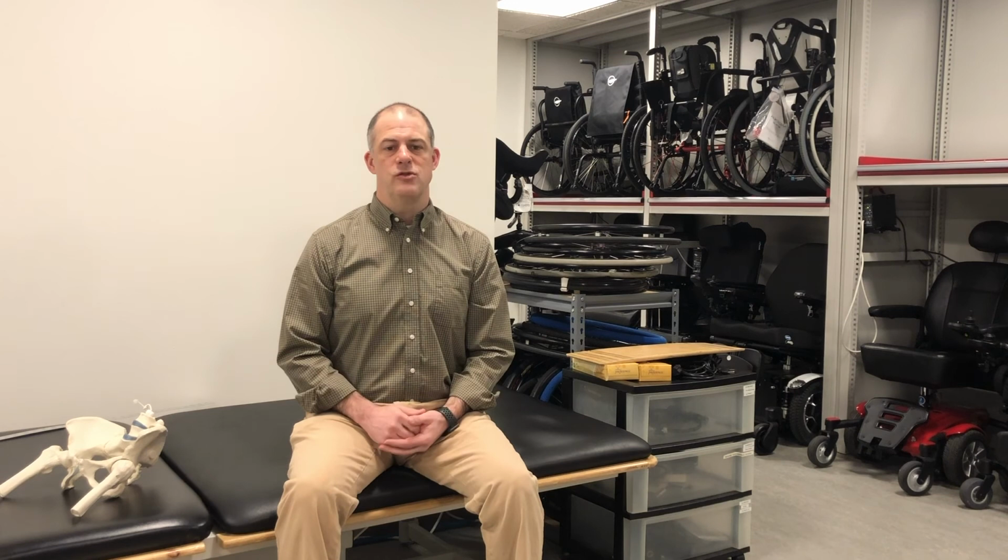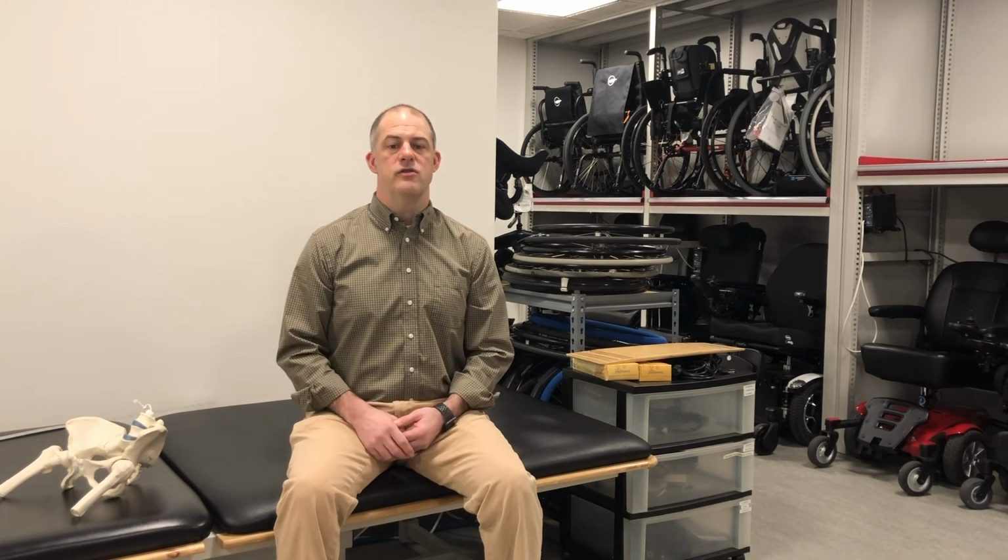As you may recall, in Module 4, we reviewed the mobility assessment and discussed the mobility device hierarchy. The hierarchy includes no devices at all, canes, walkers, manual wheelchairs, scooters, and power wheelchairs. The seating and positioning assessment and the mobility assessment provide the foundation for the next module. In future modules, we will use the hierarchy to translate the results of the assessment into recommendations for specific seating and mobility devices and features.